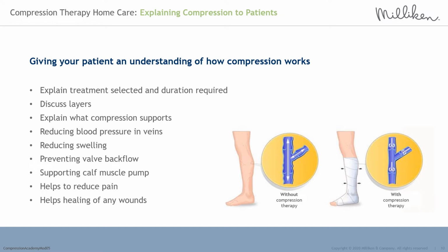The external squeeze from compression reduces the pressure and strain on the valves, supporting the calf muscle pump. The compression acts as a semi-rigid wall for the calf muscle to work against or work with to maximise the pressure exerted to empty the deep veins and drive venous return.